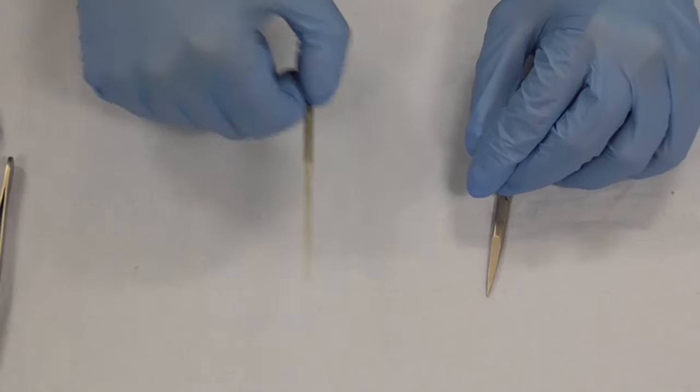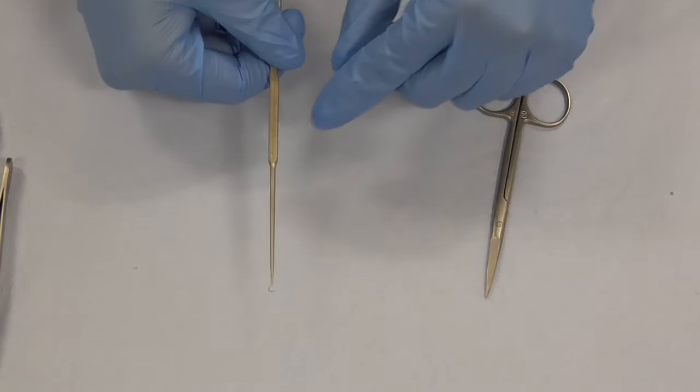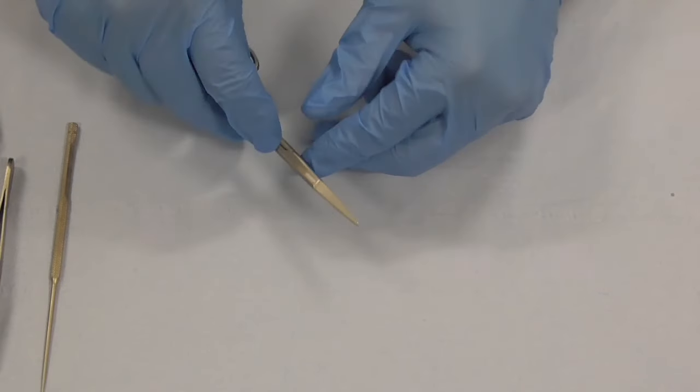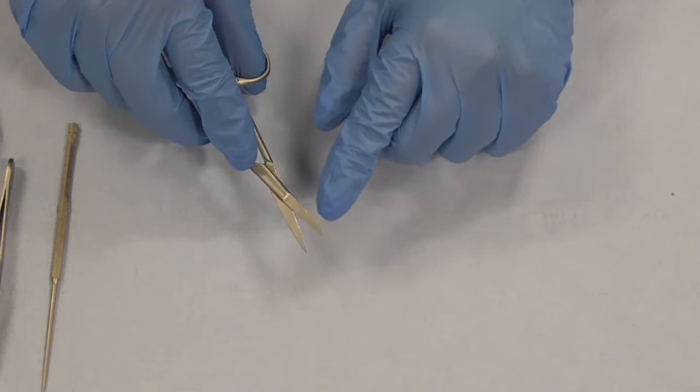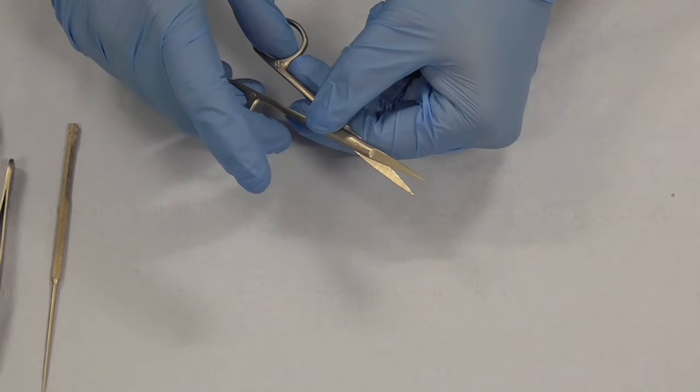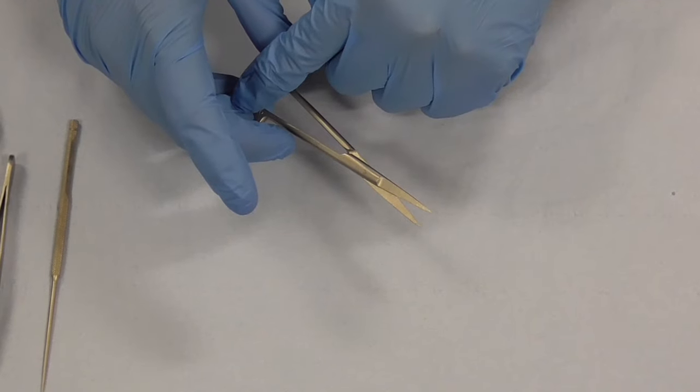So that's your dissecting forceps, that's your skin hook which is as it says on the tin, a hook for the skin. And the final thing is our suture cutting scissors and a suture cutting scissors is just a normal pair of straight scissors and again you hold it like you hold your needle holder, thumb and ring finger.